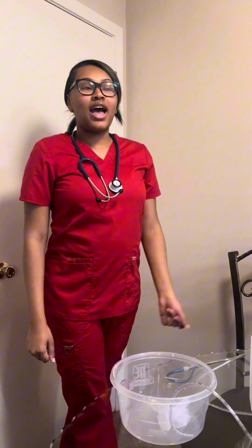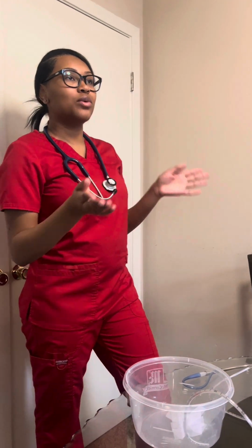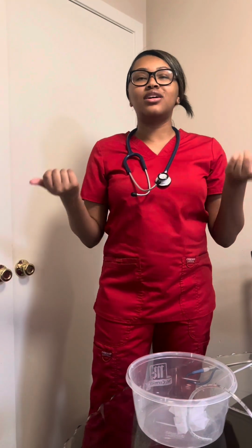Okay, so before I enter the patient's room, I would check the patient's chart, I would check the physician's orders. I would check for the rate, the route, and the type of formula that I will be administering. I will also obtain a baseline weight to determine whether I should increase or decrease after the initiation of feedings. Then I will gather my supplies, I will come in the room, wash my hands, put on gloves.